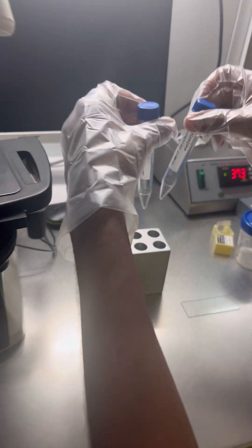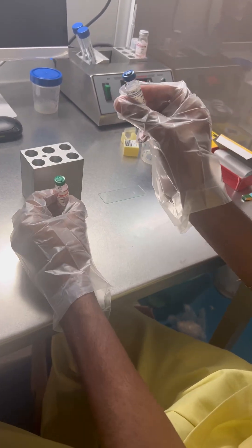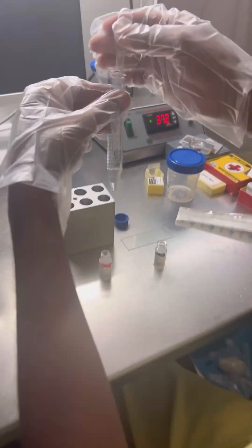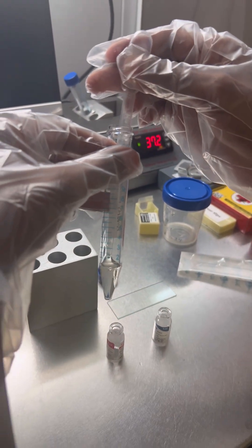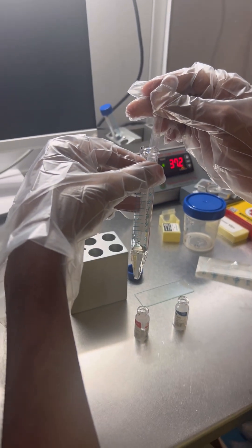IUI preparation: we have kept two test tubes in the warmer along with the media. There are two medias — the lower media and the upper media. We take the test tube and put the lower media first, which should be warmed at 37 degrees. Then we put the upper media, sliding it down the wall of the test tube so that it doesn't mix with the lower media.